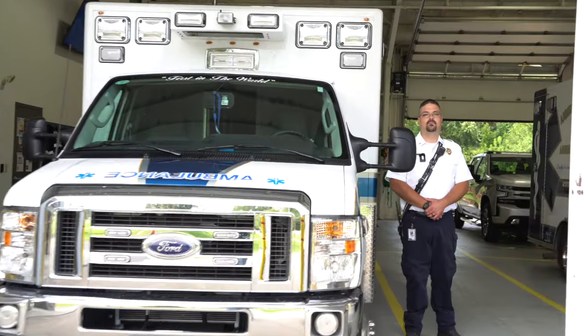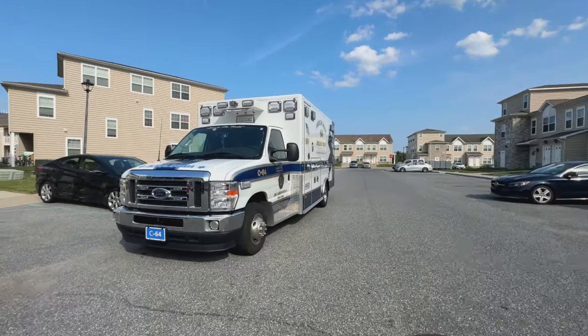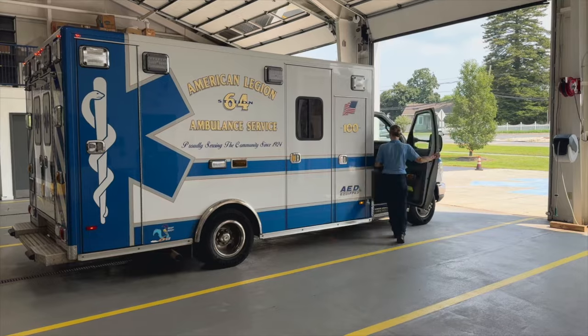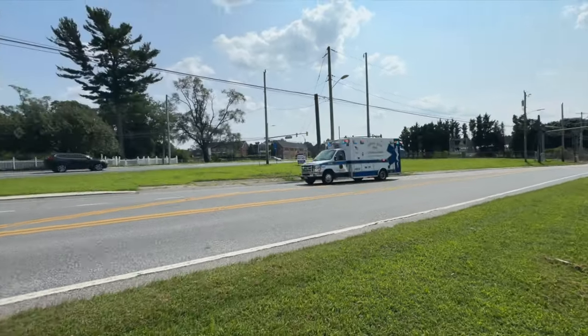Today we're meeting up with Jason, the assistant director here. He's going to walk us through the truck and tell us all about how they set it up and what it's all about. Here we have a 2024 E450 on a gas chassis built by PL Custom. They currently have four of these ambulances in the fleet, the oldest one being five years old.